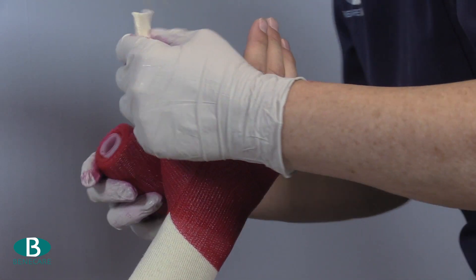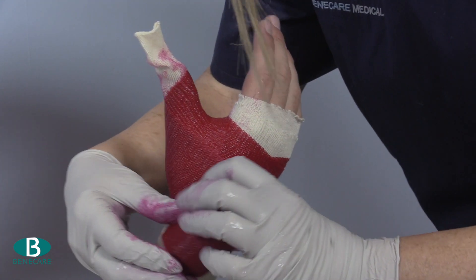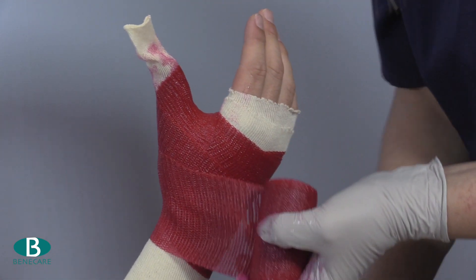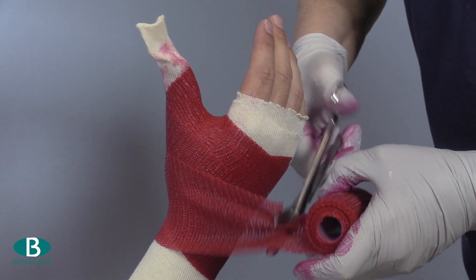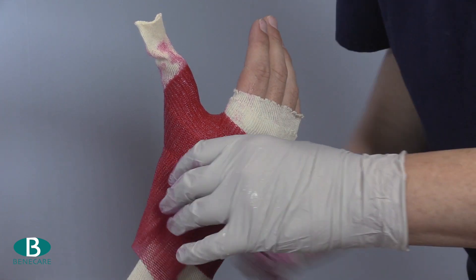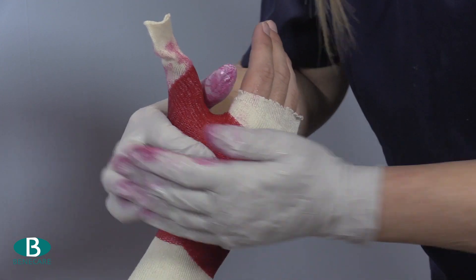Now complete the cast by wrapping around the wrist twice more. If applying adhesive hook and loop, it is advised to apply it at this stage and wrap with a wet bandage to secure the adhesive onto the polyurethane resin. It can be applied at the end but please ensure the cast has dried out thoroughly first.